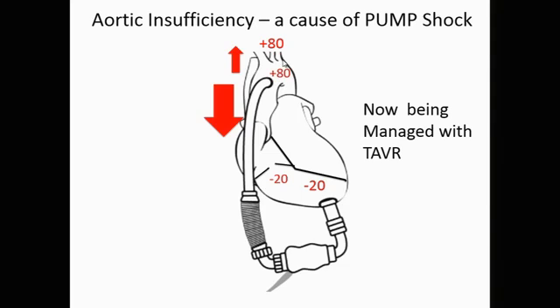in the aorta. Now, in all the distal arteries, the subclavians, the carotids, and of course the body, those are all high resistance circuits, and there's not a lot of opportunity to run off there. On the other hand, on the other side of the aortic valve right here is a pressure of minus 20. So with this device, it pumps 5 liters a minute, there's a pressure of 80 here, and a pressure of minus 20 here. Where does all the flow go? It goes backwards through the aortic valve into the LV.